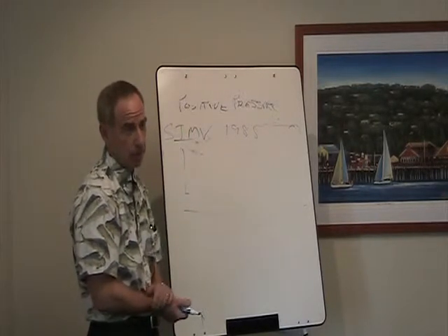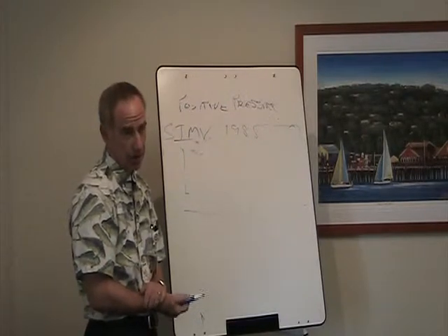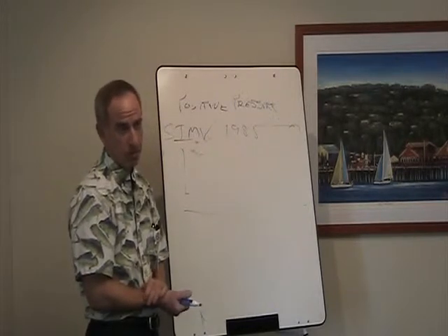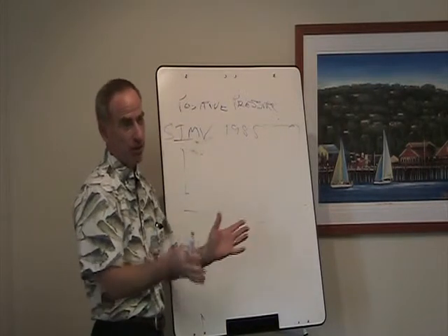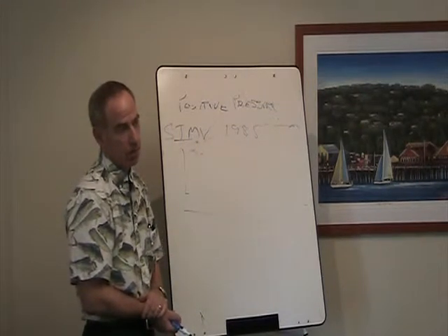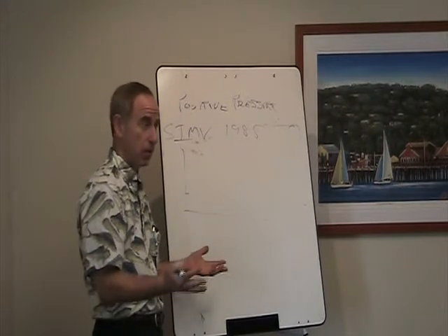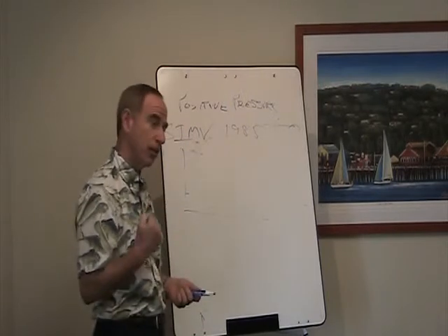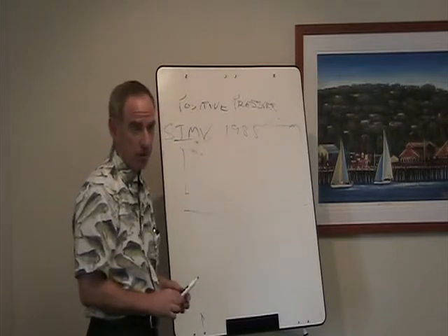Okay, so PEEP was developed in the 60s. In fact, in the first description of ARDS by Petty and Ashbaugh in 1967, they described the use of PEEP to treat it, which was interesting because they were describing the syndrome and they had already figured out a way to actually treat it. So PEEP and CPAP have been around, but neither of them are modes of ventilation. They're something that you could use with ventilation to support ventilation, but they're not ventilating people, right? You're not giving them volume, you're not assisting their breathing in either of those modes.